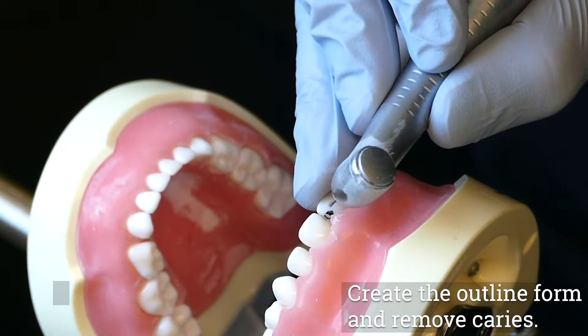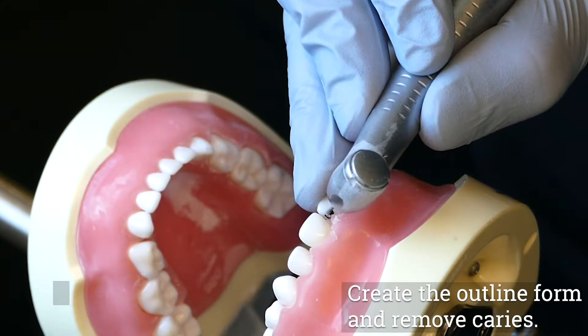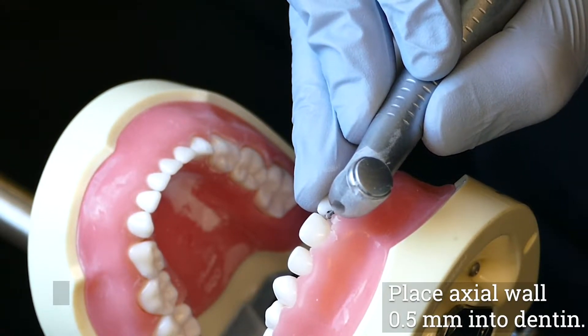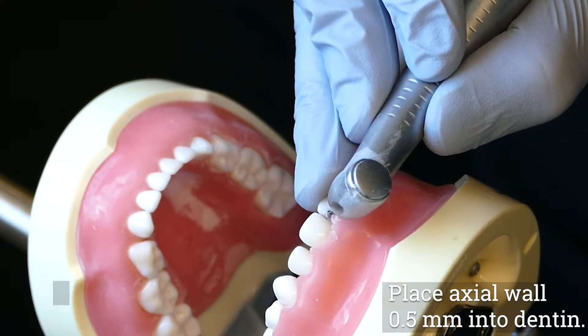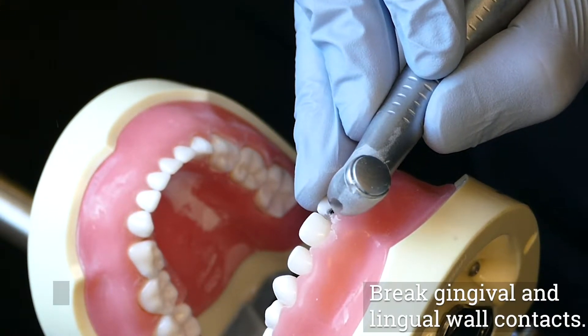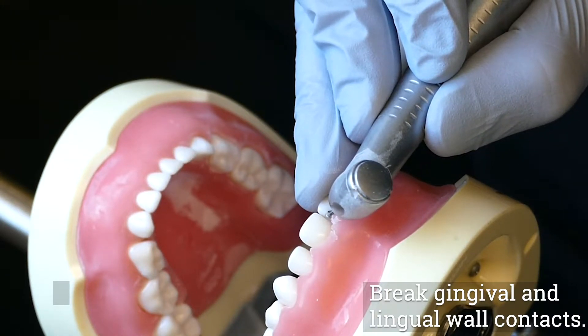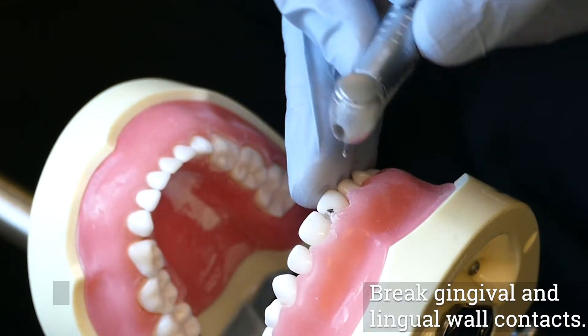Create the outline form and remove caries with a number 330 burr in the high-speed handpiece using the facial access. The axial wall is ideally placed 0.5 millimeters into dentin. A number 2 or number 4 round burr in the low-speed handpiece can be used to remove deep decay. The gingival and lingual walls should just break contact with the adjacent tooth. In order to maintain adequate tooth structure, it is not necessary to break contact with the incisal wall.